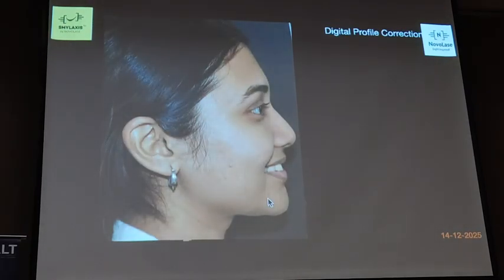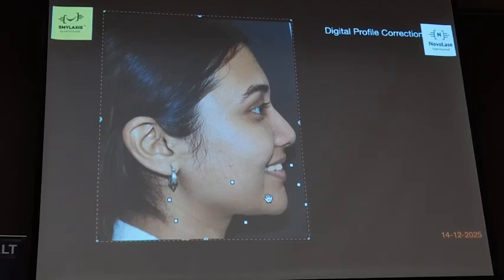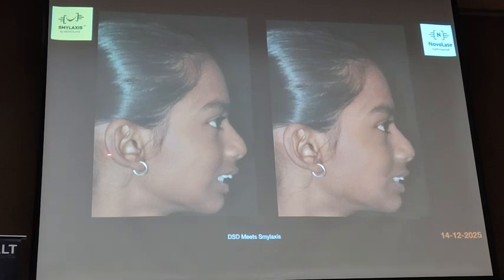Because there are different cases. Like you look at this case, suppose if you want to show a patient how to correct the prognathism, surgical correction also you can show like this. You can move the mandible, see, front and back. For this, many paid software charge a lot of money, which you can do in smile design.